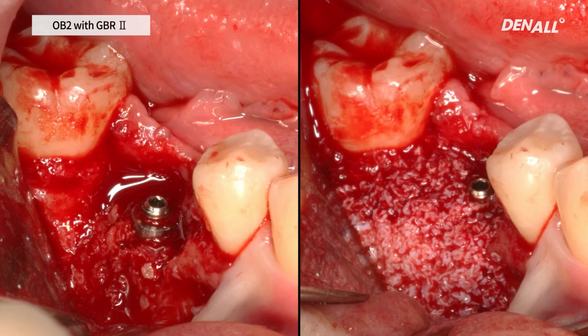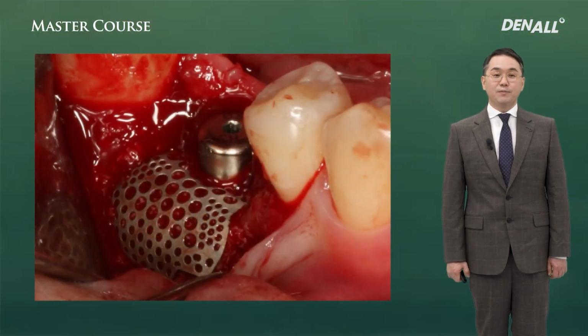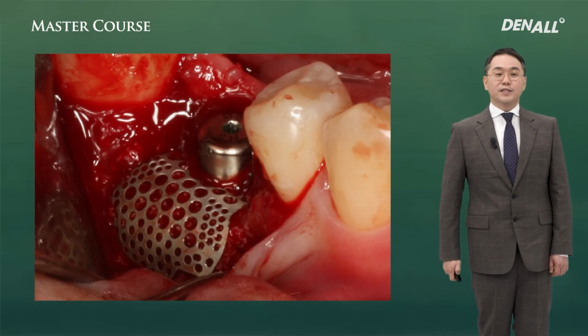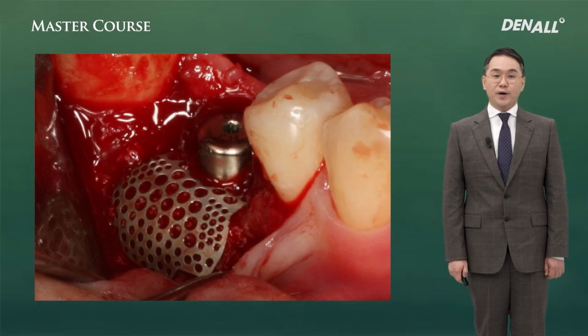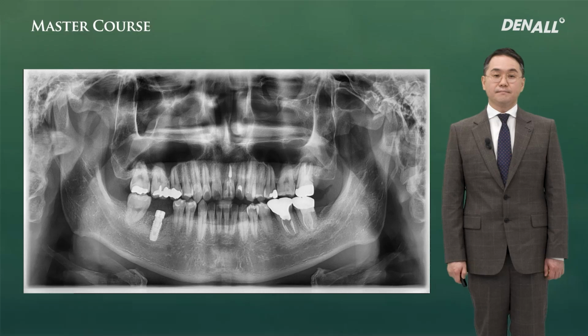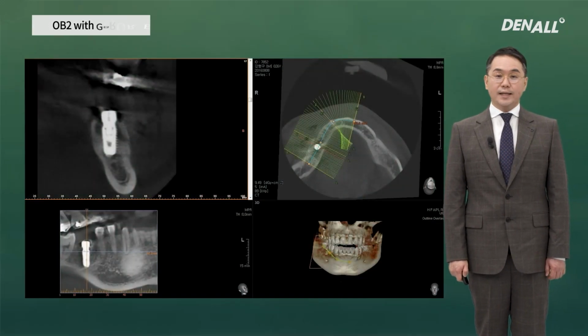As you can see in this image, before bone graft, you can see that the anchor is connected. After that, the soft tissue was lacking because it was immediate implant placement. In order to do GBR in a non-submerged way, Ossbuilder was fixated using a healing cap. Primary closure was done. This is the post-op panoramic image, CT scan.